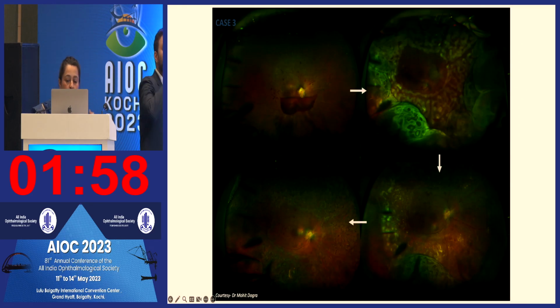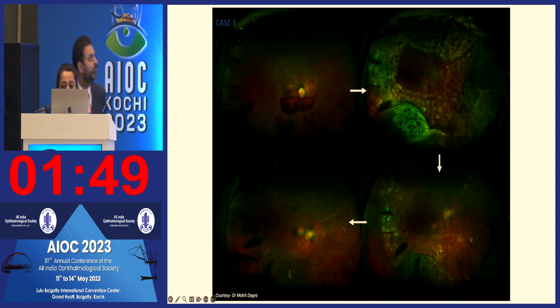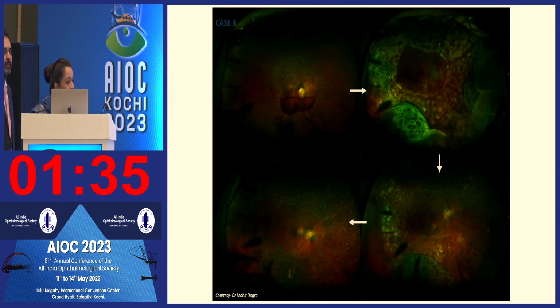This is a case of a monocular patient. Okay, this is another case where she underwent diabetic vitrectomy. It was a treatment-naive retina. That is POD1 here with 360-degree CDs. She was managed only on topical steroids, and she resolved. So these are the 3 cases of the transvitreal fibrinoid reaction you can say over the spectrum. We can discuss this. Thank you.